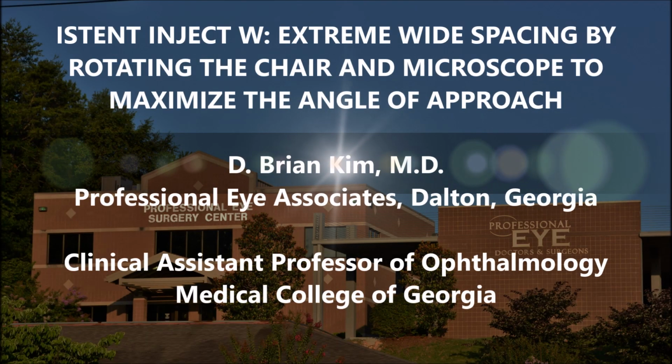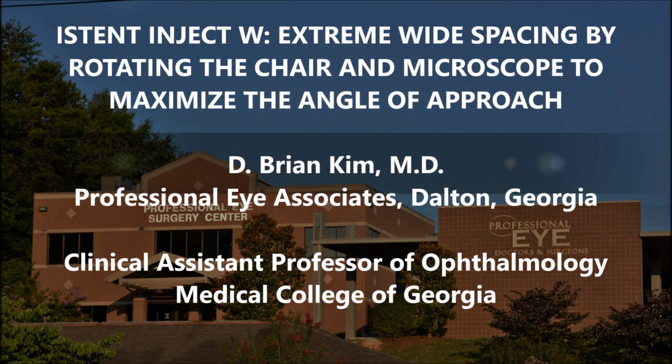I'm going to share with you this case of a patient who had cataract surgery and then underwent iStent inject W placement. And I'm going to show you how I'm able to position the chair and the microscope in order to maximize the angle of approach. And you're going to be able to see how the two iStents are placed really quite far away. And this really is very important because you want to maximize the angle to be able to hit as many collector channels as possible, which will maximize the IOP reducing effects of the iStent inject W.